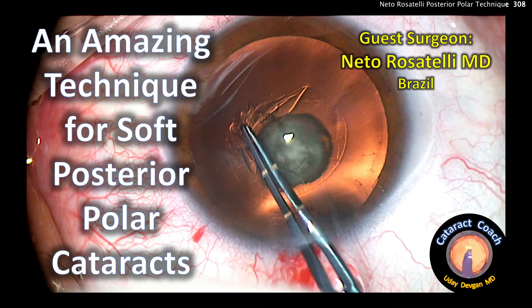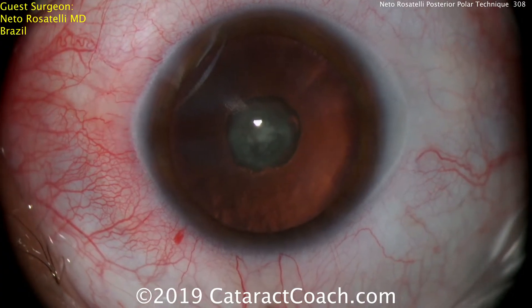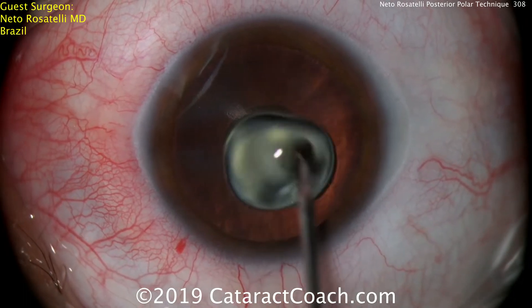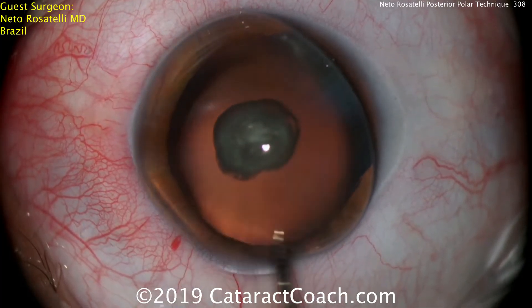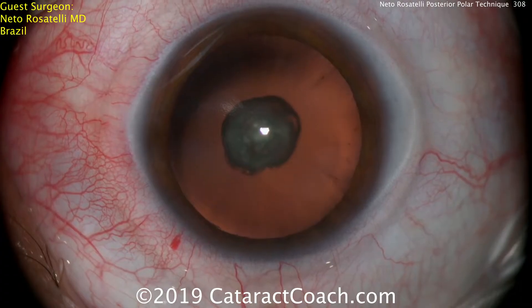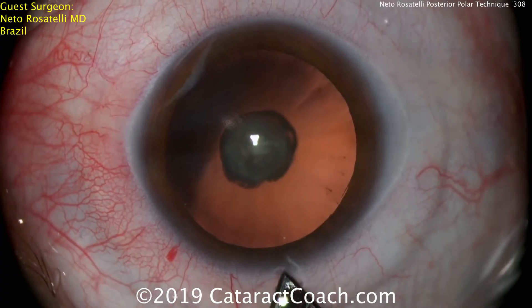Welcome to cataractcoach.com. I want to show you an amazing technique for soft posterior polar cataracts. Our guest surgeon is Nito Rosatelli from Brazil. This is a young patient with a posterior polar cataract. We're going to start off by putting some dispersive viscoelastic to protect the cornea and give the surgeon a better view. We know in these posterior polar cases that the capsule can be frankly absent, fragile, or very weak.